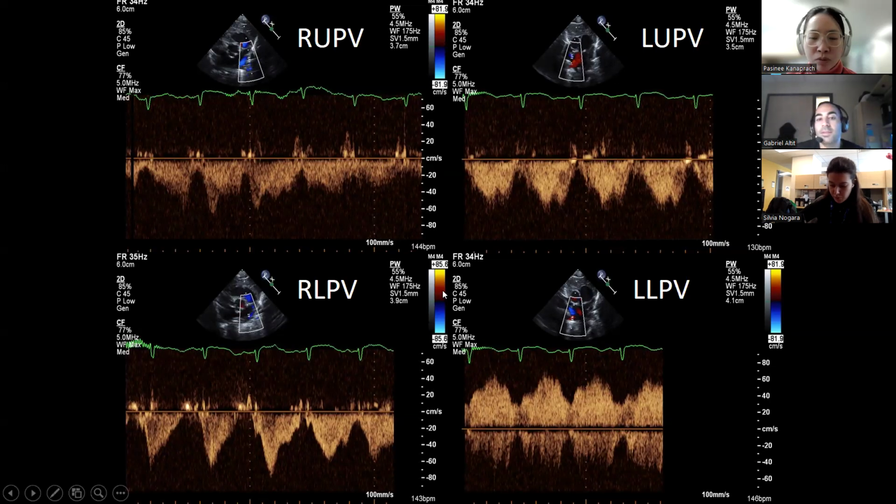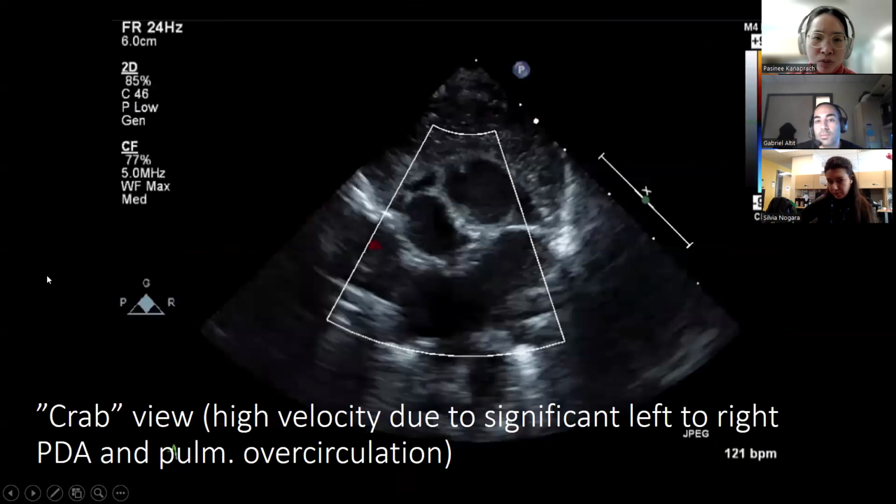Because if you lose these phases, it's a sign that there might be turbulence and that your ostium has stenosis, which you can see in patients, for example, post-op, or in patients that had lines that were too deep, which start traumatizing the ostium of the veins, and then the vein starts fibrosing. Or you can see it in BPD pulmonary hypertension. In some of these babies, they can develop multivenous disease for some reason. We're not sure why some of these patients develop that.